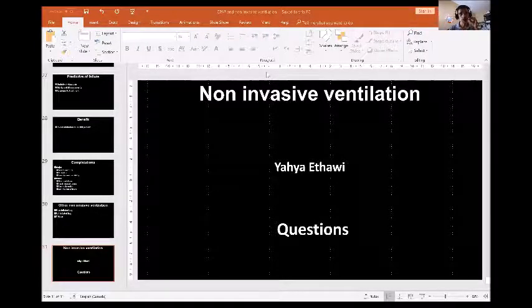No. There is 15 here. People are asking me about it. There is 15 in continuous, whether it's variable flow or continuous. There is 15 in CPAP, and there is 15 in bilevel CPAP. In bilevel CPAP, the EPAP you cannot reach 15. The IPAP can be 15 to 22, while the EPAP can be from 6 to 7, or 5 to 7, or 8 sometimes. But in plain CPAP, not bilevel, whether it's continuous or variable flow CPAP, you can reach up to 15.